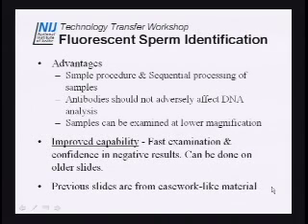Fast examination, confidence in negative results, and it can be done on older slides. Again, you can't do the laser microdissection or laser capture on the older slides, but you can examine them. The slides I just showed you, we have done this on some casework samples because we've gone back and I've looked at some old slides from cases that analysts worked a while ago. But the one that I showed you was actually a K-mix, our known mix that we use in our preferential lysis. I just went back and picked up an old slide and stained it and got those results. That slide was probably at least a year old when I looked at it.